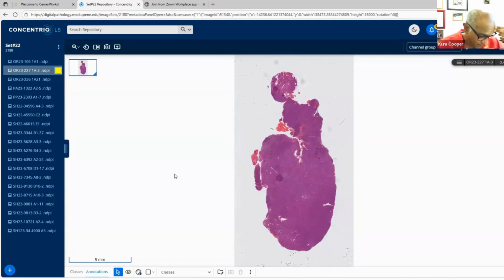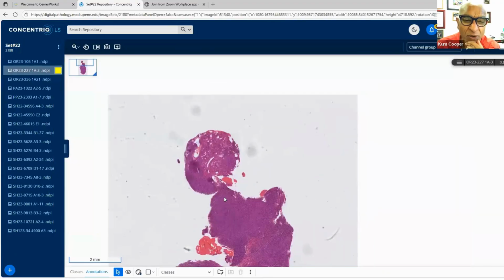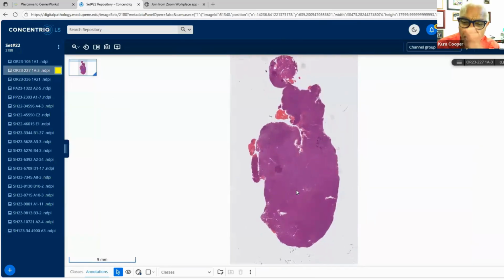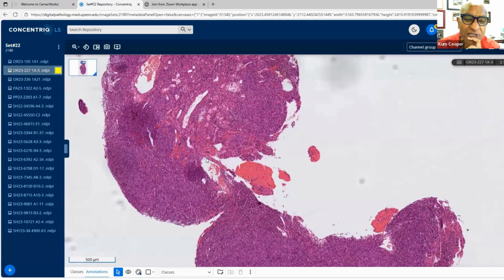So the first case I put up here for you now is a 50-year-old woman, and this is an endometrial curettage. So here we go. This is what we received, and I saw this a couple of years ago from one of my GYN colleagues who showed me this case, and I will share the morphology with you. Well, just on low power, you can see that it pretty much looks almost polypoid, but I don't want to put any ideas into the diagnosis or the differential diagnosis, but just show you the morphology.